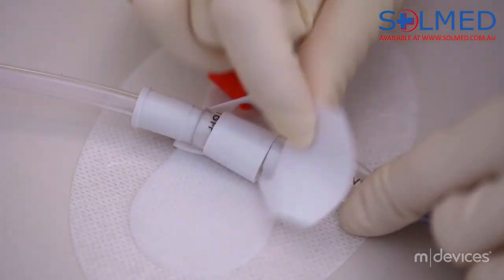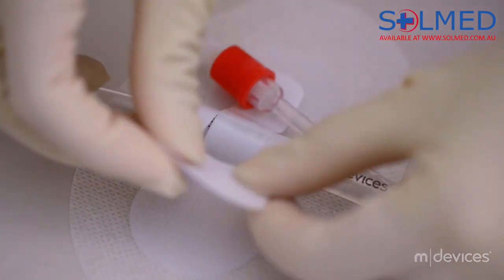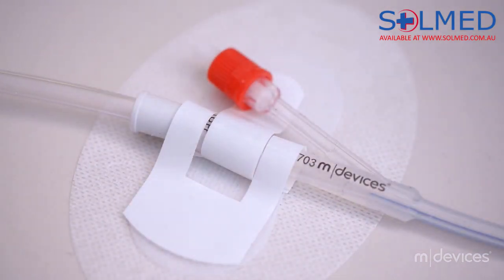The tabs can be re-lifted numerous times if required until the catheter is firmly secured in the desired position.